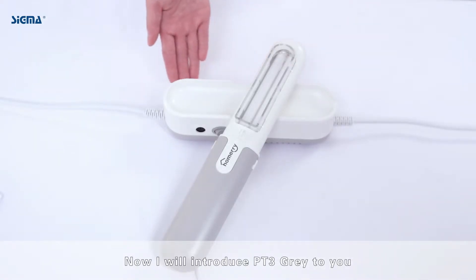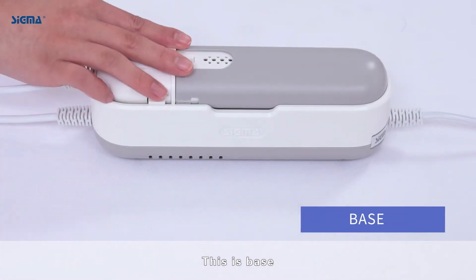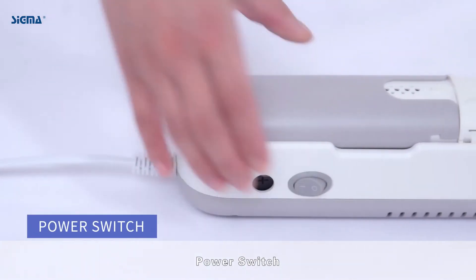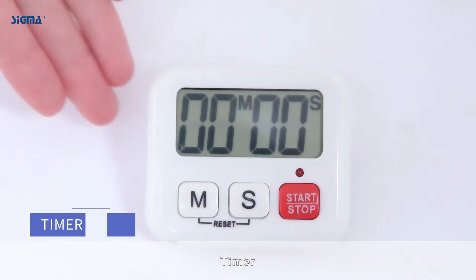Now, I will introduce PT3 Gray to you. This is an irradiator. This is the base. Power switch. This is anti-UV goggles. Locating ring. Timer.